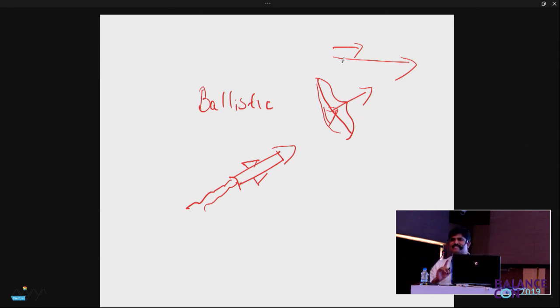In the eye movements, saccades are considered as ballistic eye movements. What are they considered as? Ballistic eye movements. Versus in the other slower eye movements, they are like pulling a cart. As long as you pull, it comes. If you stop, it stops. There is no initial charging that decides where it lands. So if somebody has to move from one particular point to another, the initial velocity is going to decide whether it is going to land here or whether it is going to land there.